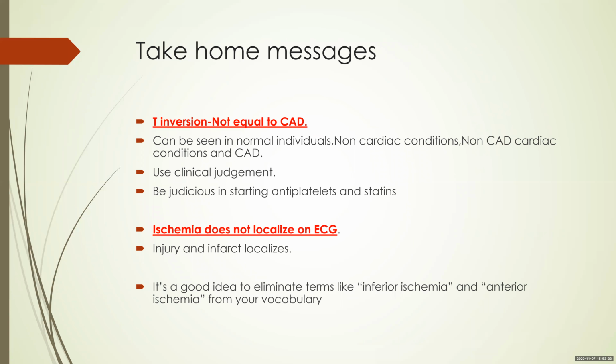Finally, take-home messages. T-wave inversion is not equal to CAD. They can be seen in normal individuals, non-cardiac conditions, non-CAD cardiac conditions, and lastly, coronary artery disease. Use your clinical judgment. Do not treat the ECG, treat the patient. Finally, be judicious in starting antiplatelets and statins. You should start in the right case and not in every case.